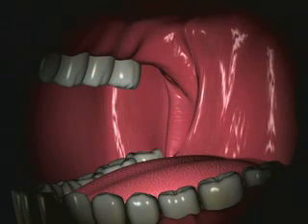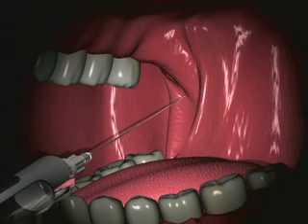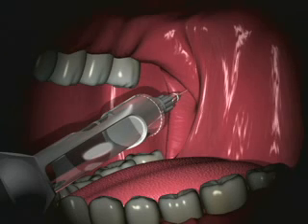Hold the syringe at the angle determined from the extraoral landmarks, aligned in a plane joining the intertragic notch and the corner of the mouth, approaching from the contralateral corner of the mouth with the needle tip aiming for the neck of the condyle. The barrel of the syringe is usually over the contralateral mandibular canine. Once inserted, the needle should be slowly advanced until bone is contacted, which should occur in approximately 25 millimeters. This point is the neck of the condyle.